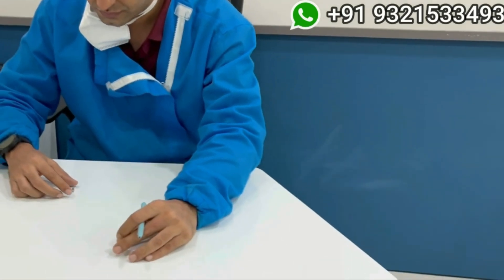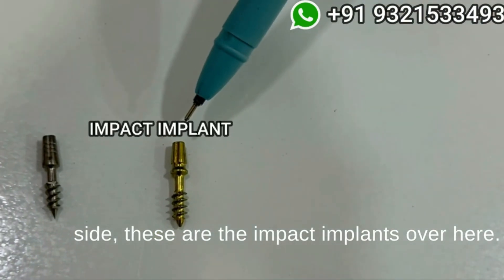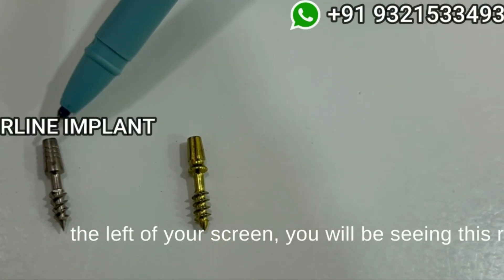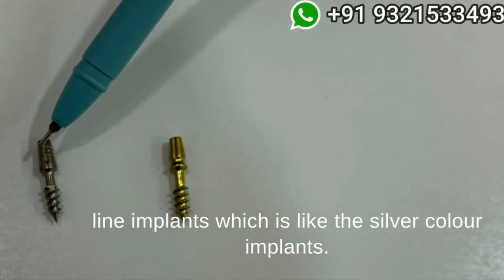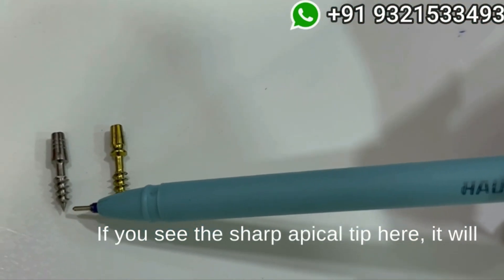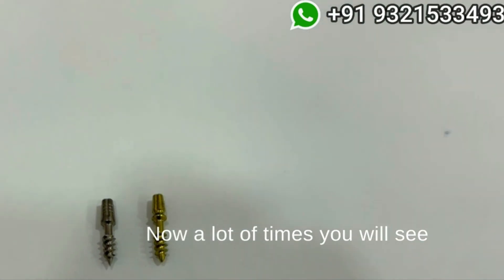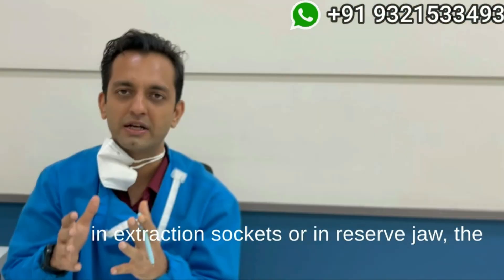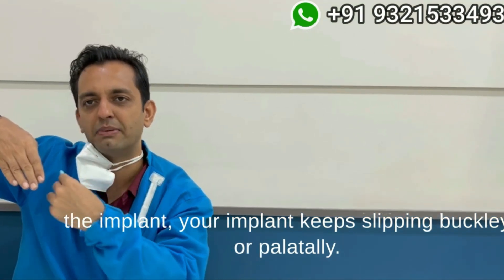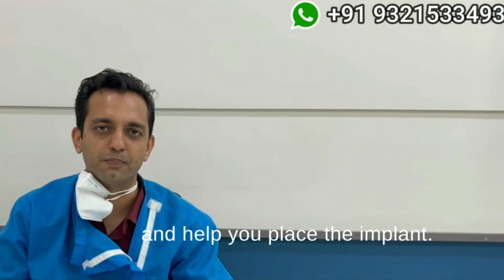On my left hand side are the Impact implants, and on my right — that is to the left of your screen — you will see the R-line implants, the silver color implants. The first important feature is the sharp apical tip. It will help you penetrate the slopes of bone very easily. In extraction sockets or in resorbed jaws, the bone is never flat — it is always sloping. When you try to place an implant, it keeps slipping buccally or palatally, but a sharp apical tip catches the osteotomy nicely and helps you place the implant.